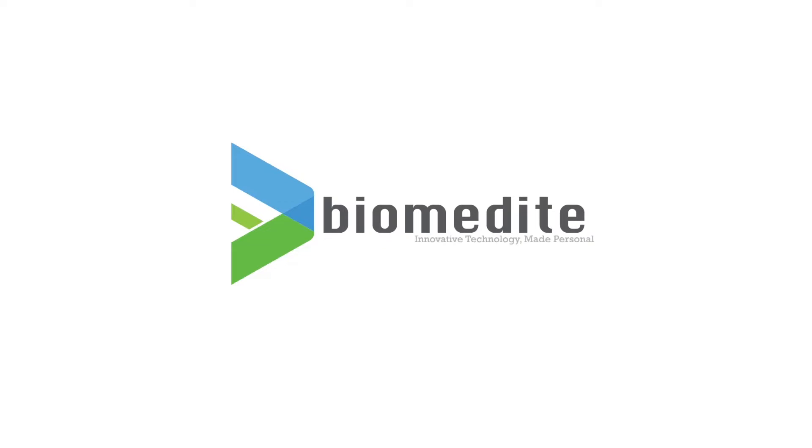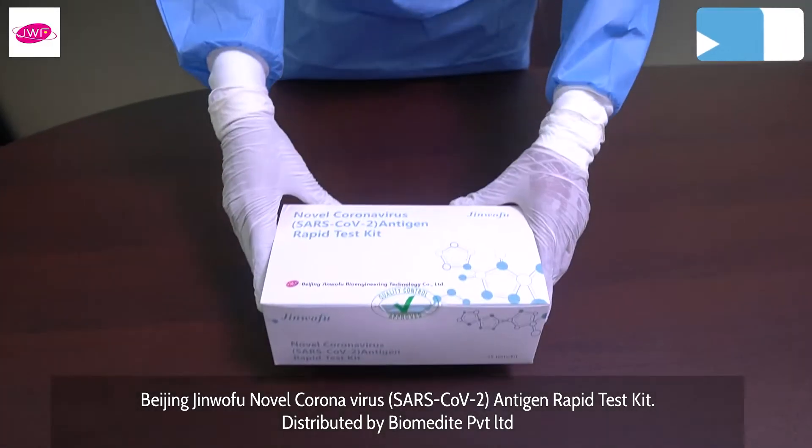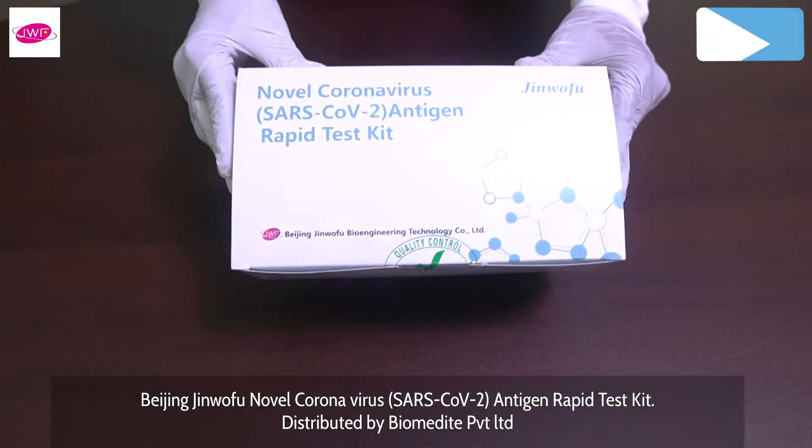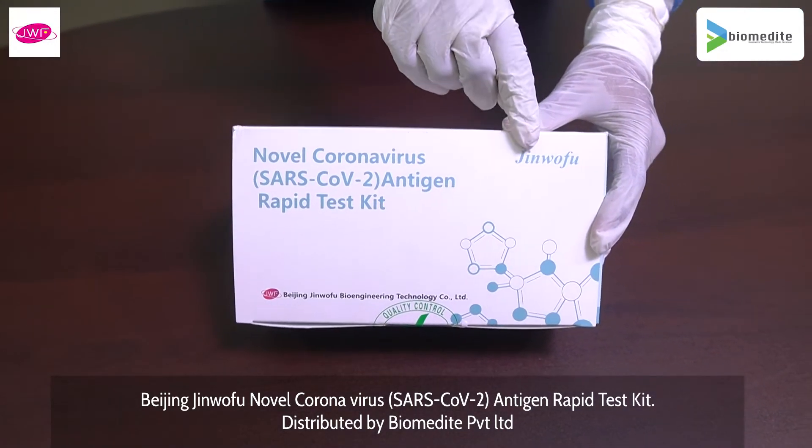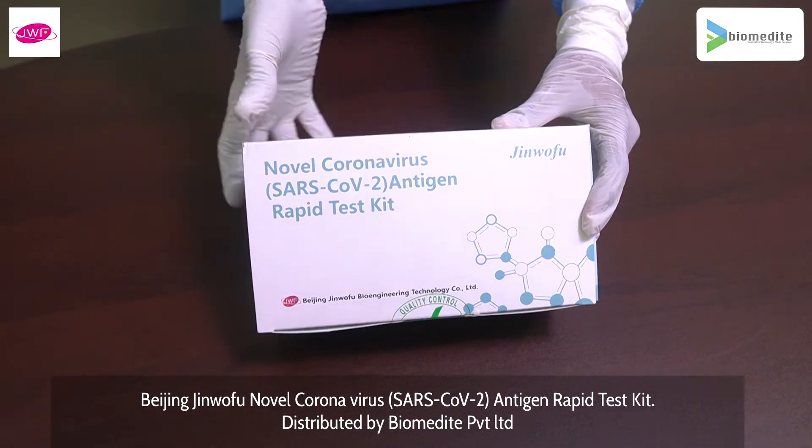Biomedite: innovative technology made personal. Beijing Jinwofu novel coronavirus SARS-CoV-2 antigen rapid test kit, distributed by Biomedite Private Limited.